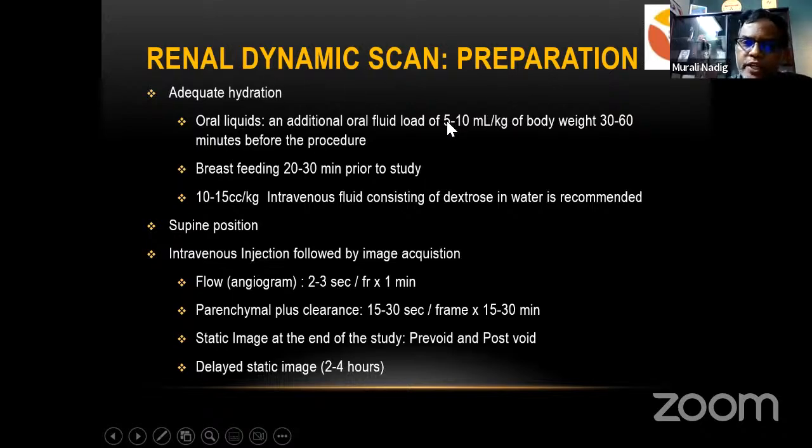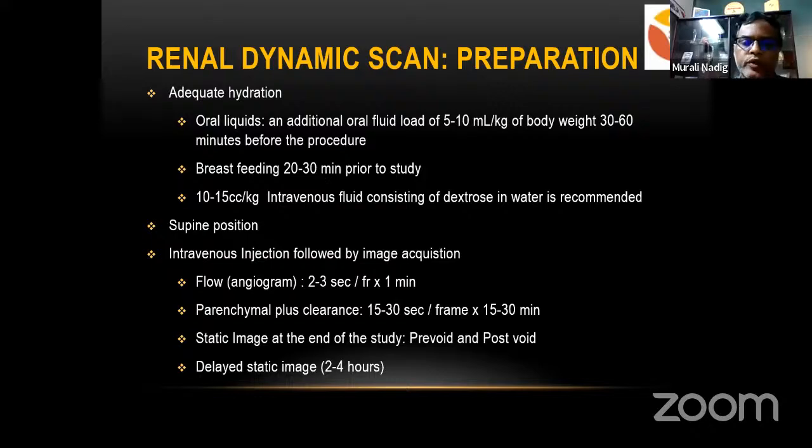For the renal dynamic scan, the preparation is adequate hydration. Oral liquids ad libitum or 5 to 10 ml per kg body weight, 30 to 60 minutes before the procedure. Breastfeeding, 20 to 30 minutes before the procedure. Or if the patient is not able to take orally, we can give IV fluids at 10 to 15 cc per kg.